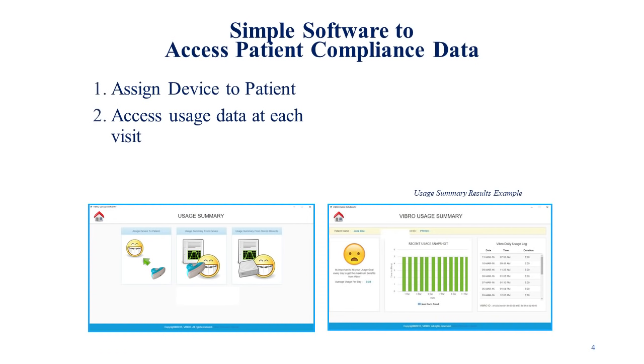Not only does that help me to explain why we may not be seeing the results that we're expecting, but because the patients know that we're going to be checking every visit, I think that helps compel them to be more compliant with the usage of the device.